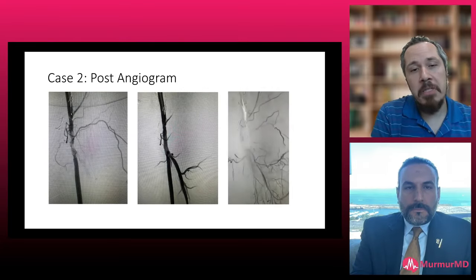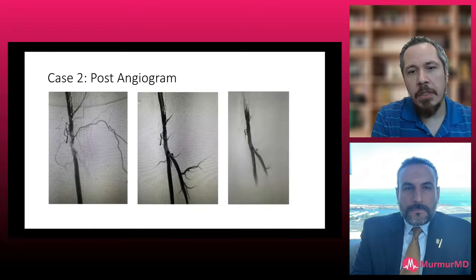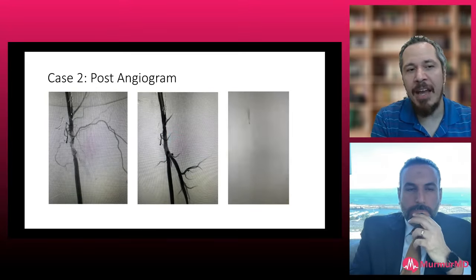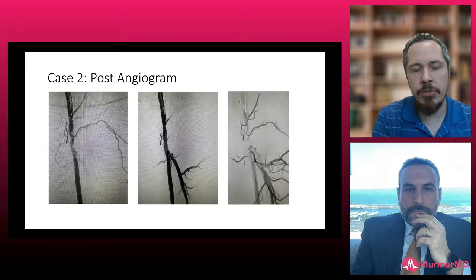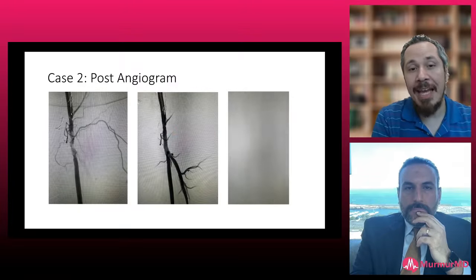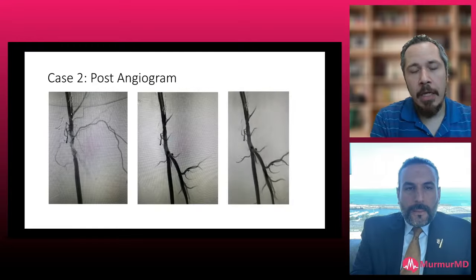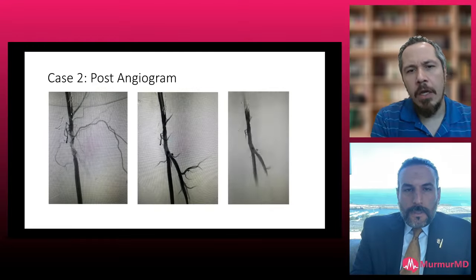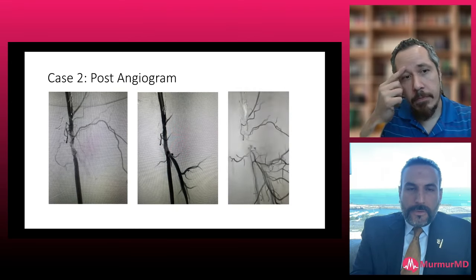And again, this is early experience. When I did it, I had to go through every step. I think it's important to have great colleagues from surgery to talk to about it, and to talk to the patient about it, not pushing one way or the other just because we can, and the patient understanding the risks. Yeah, I mean that's an absolutely beautiful result.